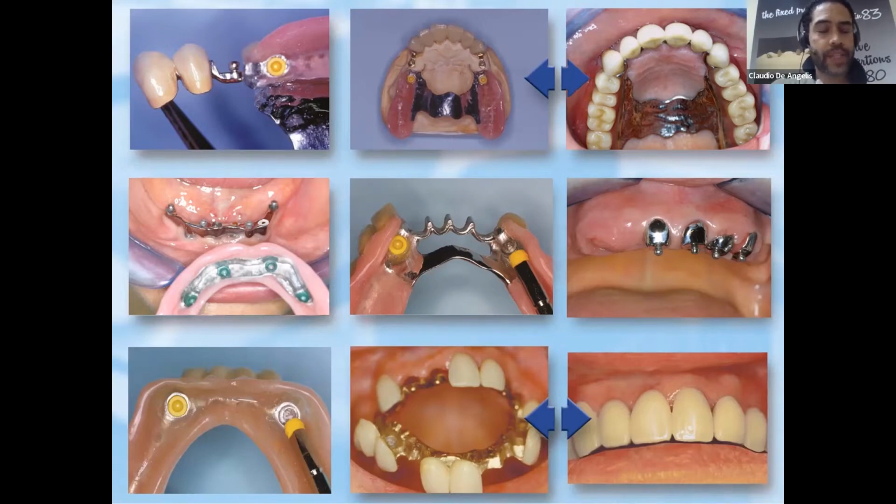For distal free saddle, bilateral, remember it's a bilateral attachment, removable dentures with a metal frame. You can use it as a single sphere on top of the bar, on root. You can basically use it as you wish. It gives you the freedom to be used as you wish, as you need, as your patient needs. Okay.